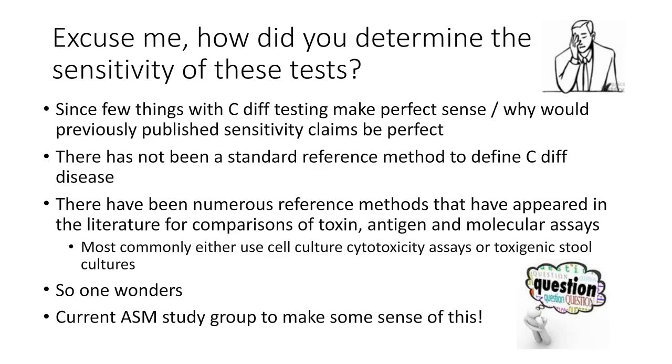If you read different literature, like I've tried to do, oh my goodness, there's so many, you can't read them all, but there's different comparative methods used to compare the sensitivities of these tests. So no one would say that all the sensitivity data that we've been given is perfect. There's not been a standard reference method to define C. difficile disease.